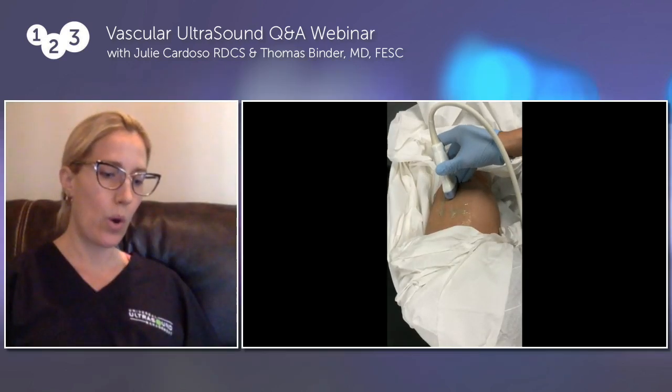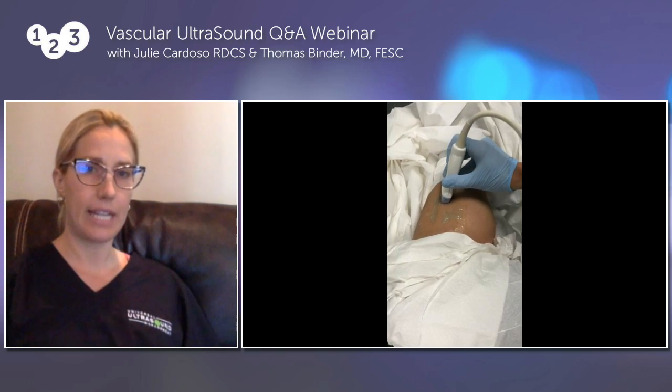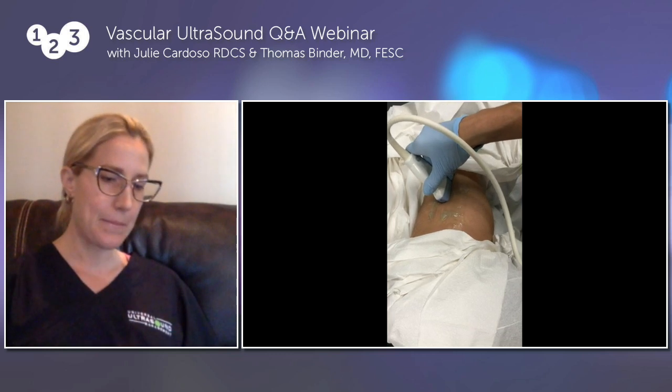If you go to the next slide, you'll see the angling where we're angling in between the X plane. And that will help us give a better visualization of the anatomy that we're looking on the leg.